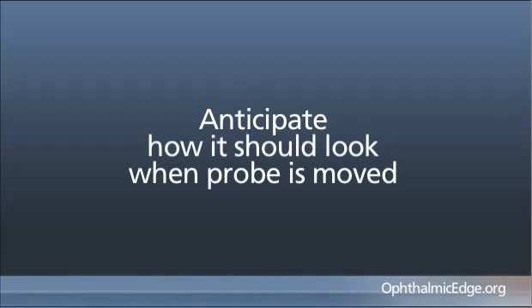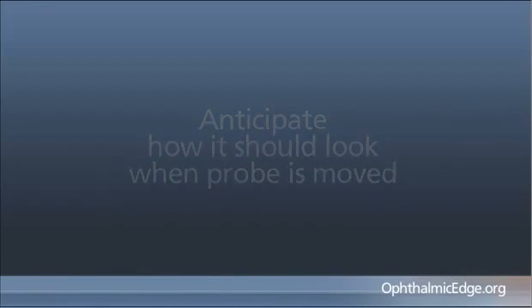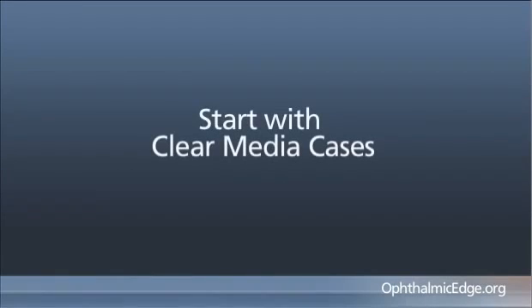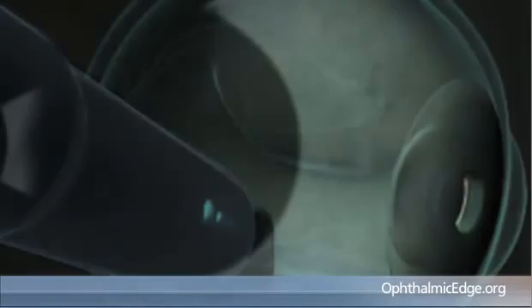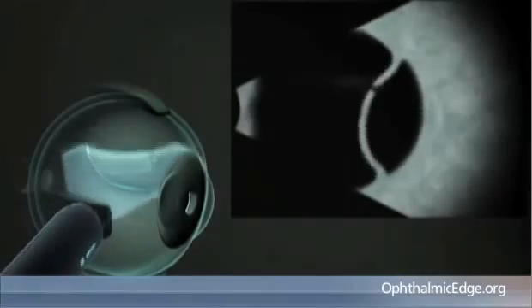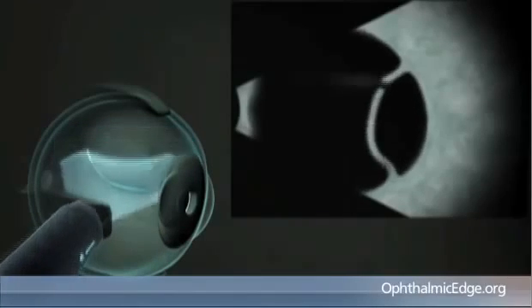It's sophisticated, it takes some time, and I recommend that most people use clear media cases, a partial retinal detachment involving perhaps the temporal portion of the globe, wherein the nasal portion is attached. Try to use ultrasound before you use the indirect ophthalmoscope. And see if you can create a retinal drawing of the topographical shapes and patterns inside the eye before you look. This becomes increasingly difficult as the abnormalities that you're looking at become more asymmetric.